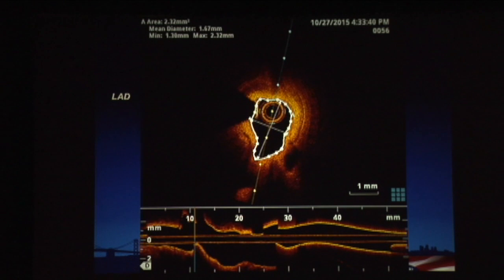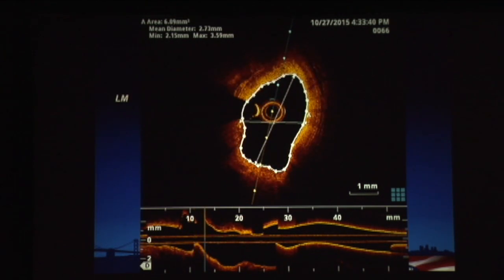So this is the cross-sectional area measurement in the proximal LAD, and it measures 2.32. I think everyone would agree that is a critical stenosis in the LAD. This is the distal left main. It's 6.09. I don't know what numbers people like to use. Some people use 6, 5.5. Some people use as high as 7, 7.5, 8. It's controversial, but I think most people would agree that's a significant left main.